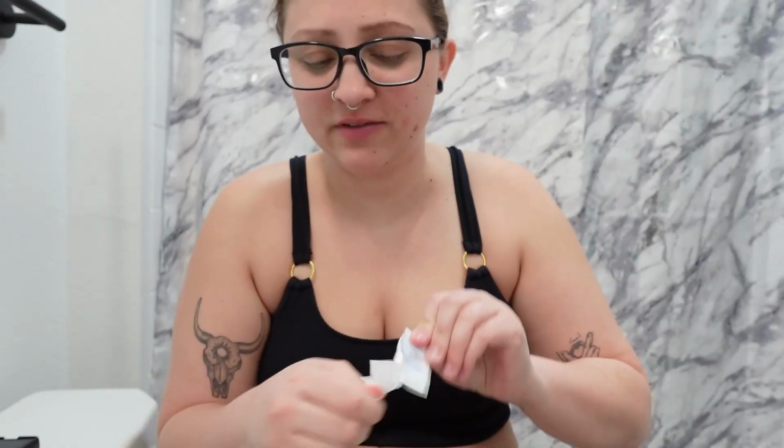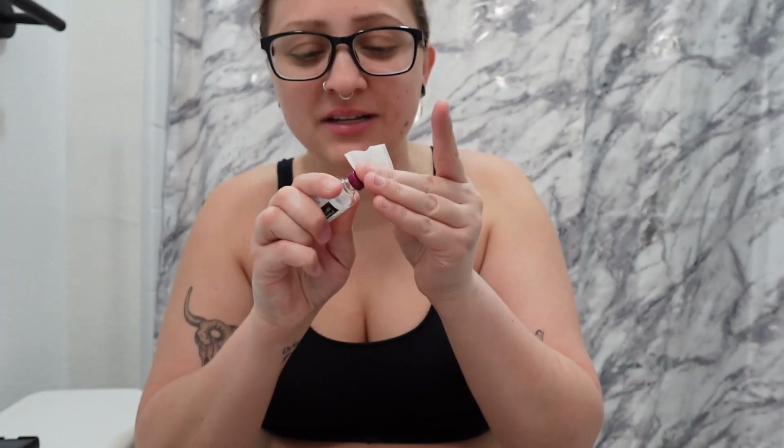So we'll go ahead and unlock it, which is literally turning it from the screen outwards, and we will discard of that. Next step is the insulin. So I just uncapped the needle like a dumbass, but I placed it on top of the needle cap because this is not a new vial. I'm trying my best to learn. I was about to do the top of the cartridge until I realized it literally just came in a package, so that's sterile.